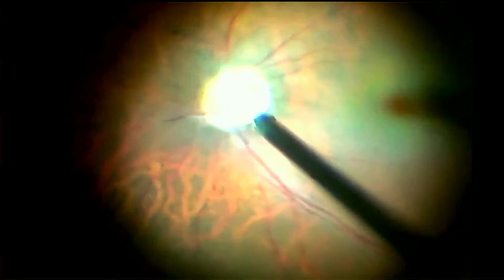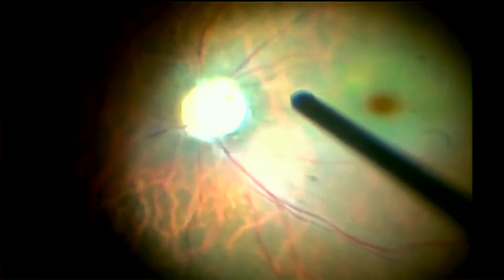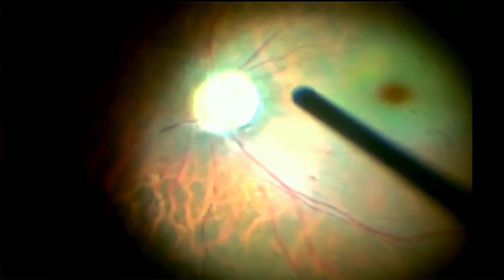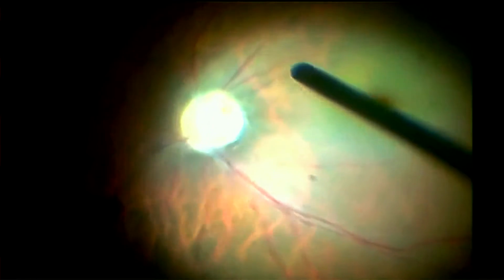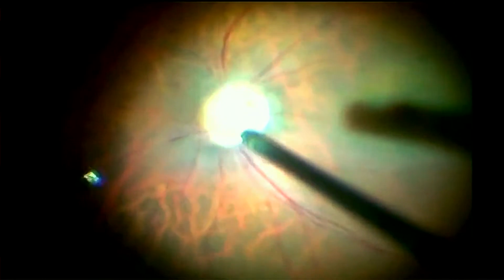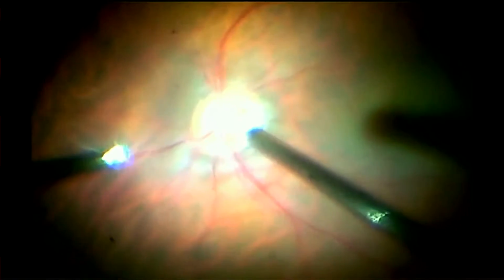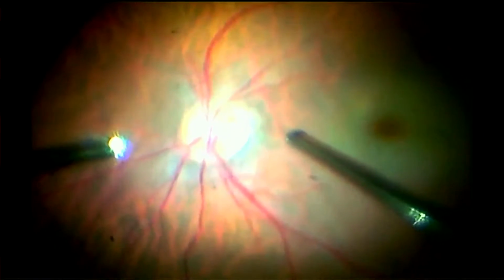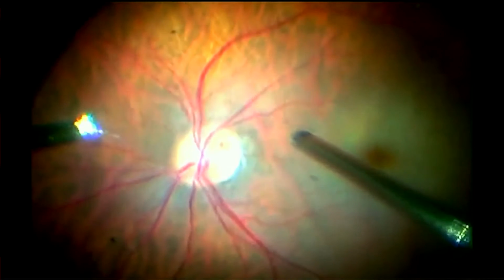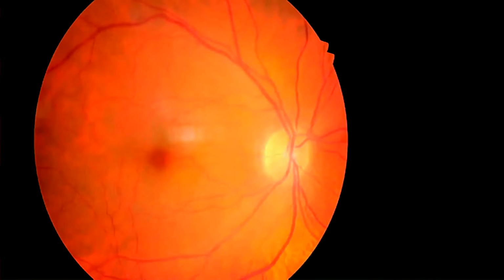Once the glial tissue has been dissected, one has to wait patiently for a few seconds. The disc then begins to show signs of reperfusion in the form of small hemorrhages on it. And then the central retinal artery pulsates back to life. The perfusion was restored almost immediately. Post-operatively, he recovered 6/24 vision.